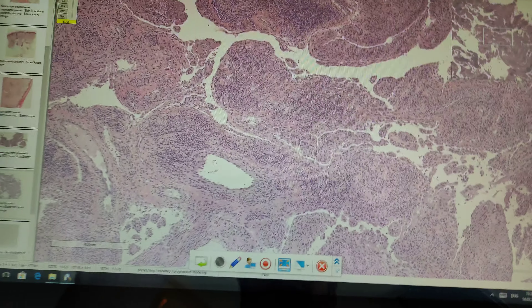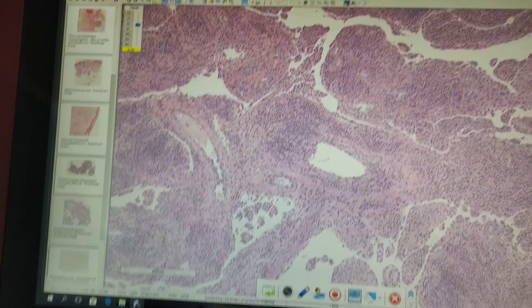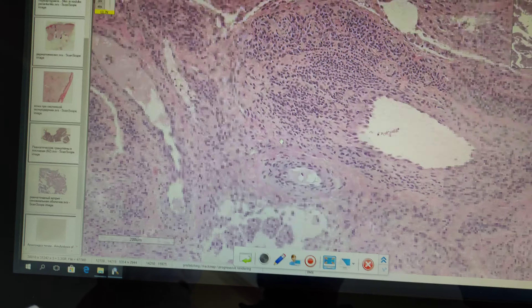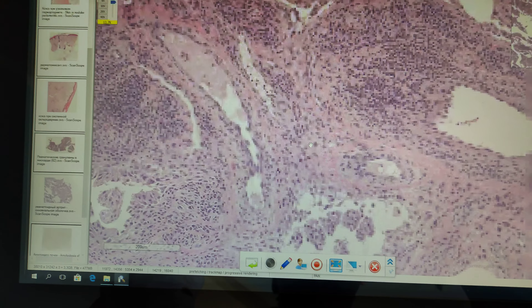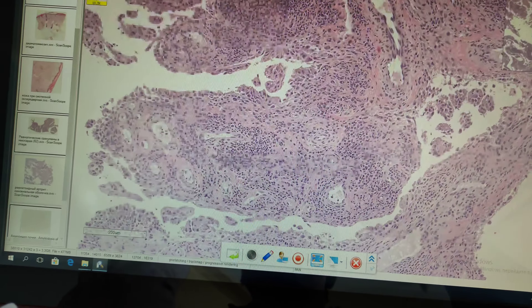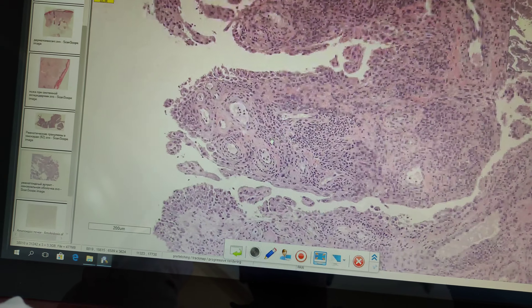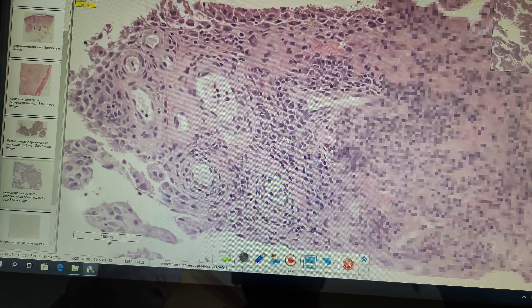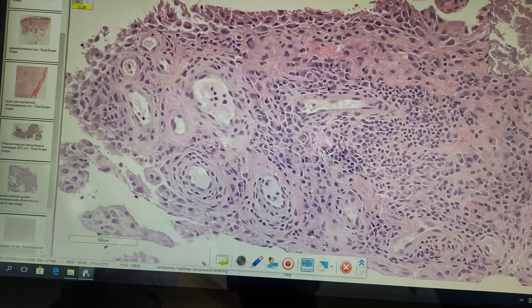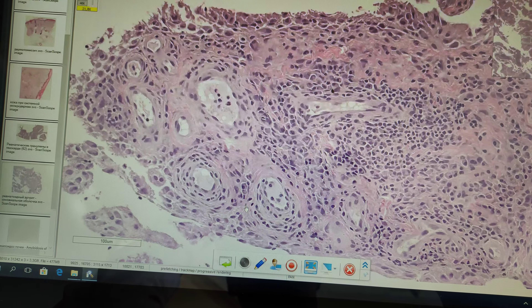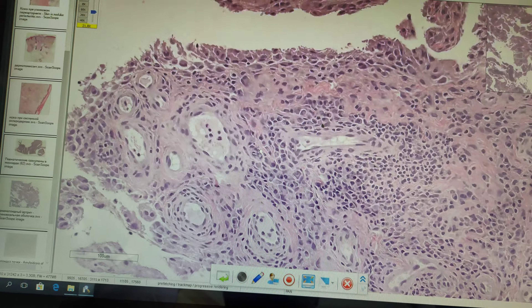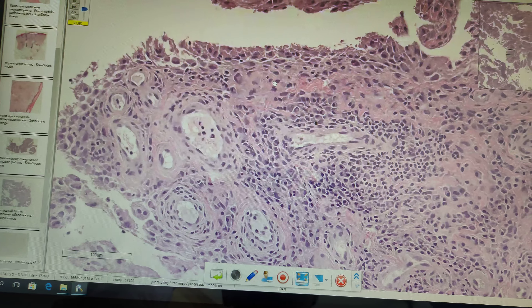What can we see here? Mostly proliferation of synovial cells. Synovial cells are polygonal with clear cytoplasm, like here. Blood vessels — multiple blood vessels — and around the blood vessels, the beginning of a scarring process of connective tissue formation.